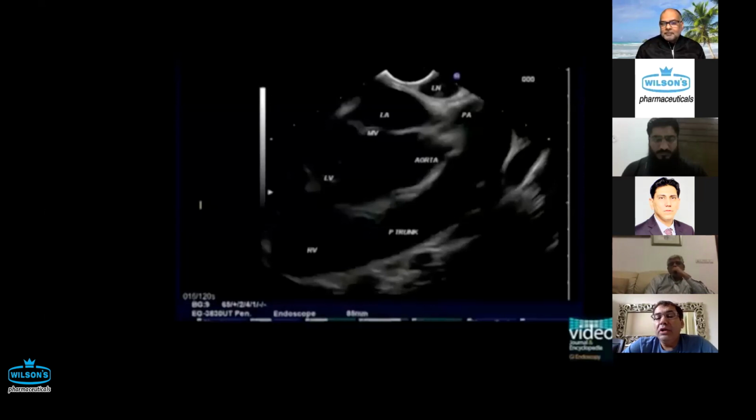The only time the problem happens is when you hit the vessel in a longitudinal wall area, so you rupture through that. When you go through the vessel at a 90 degree angle or anything, no problem. It's just when you rupture the wall alongside the vessel that's where the problem is. So if you think there's a lot of vasculature, but you have to do a FNA, don't use a core needle. Use a FNA needle. Don't use an FNB needle in that case. So you'll be fine.